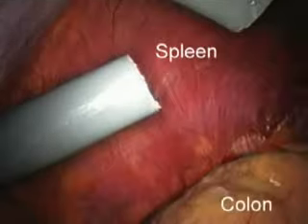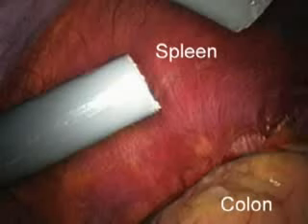This trocar, which can be seen on the video, is the subxiphoidal trocar, seen on the left side, whereas the upper trocar is the pararectal one. After all trocars are placed, the spleen and the left colonic flexure are well visualized as illustrated in this image.